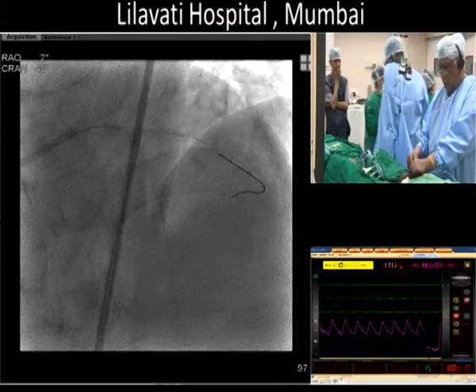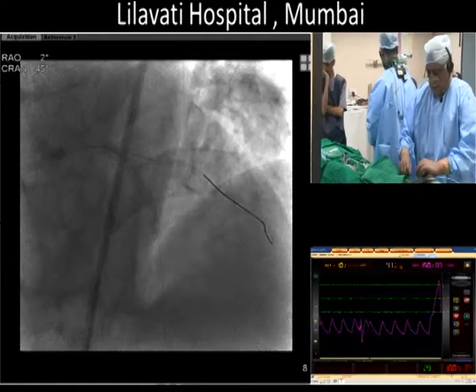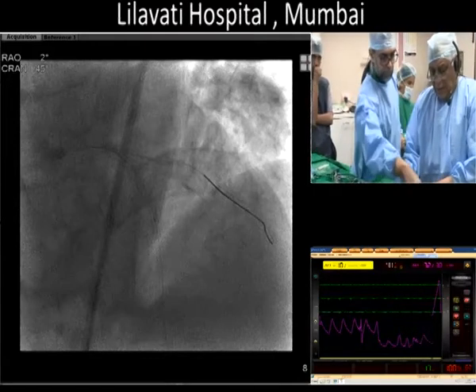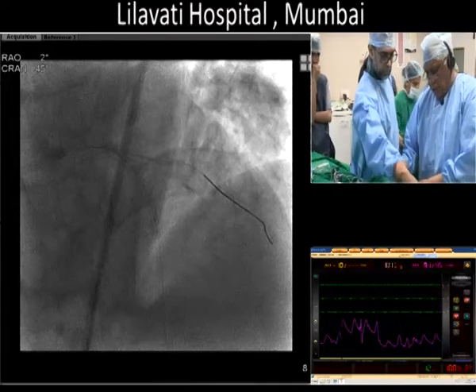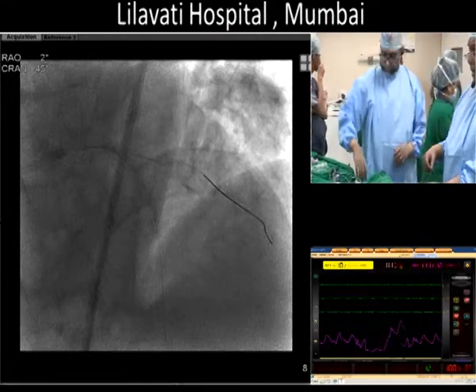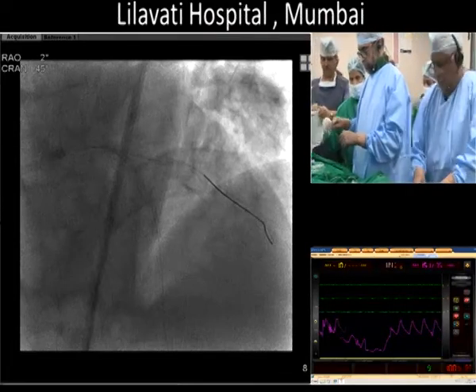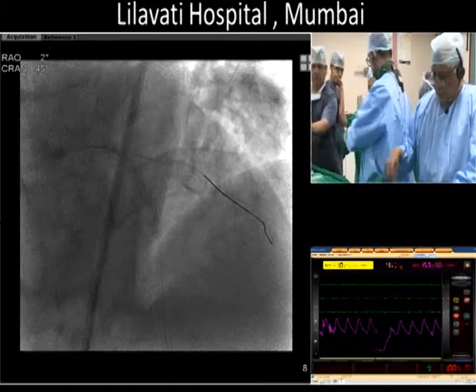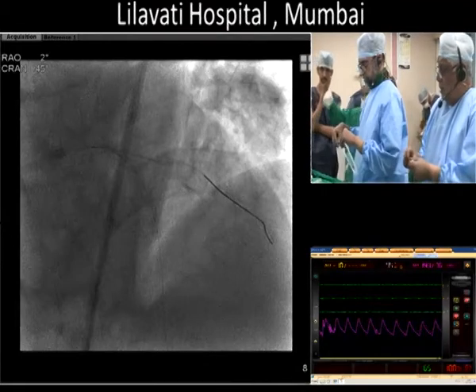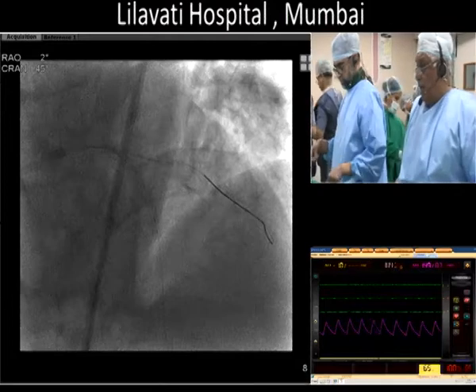It's something I've seen some operators do. He's going to have to go back and expand here. Why I did that is because the diagonal is just bang from the ostium. So I almost don't like a V stent. It's like a common V-stent. So I think you would have to post-dilate the diagonal a little bit in the midsection, and then perhaps at the new carina that is created, maybe a kissing balloon, high inflation, high pressures there. Yeah, I think we did that.